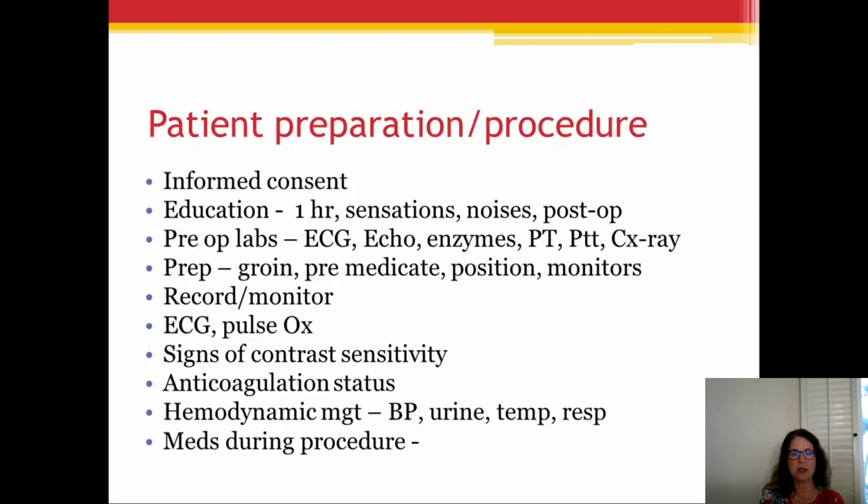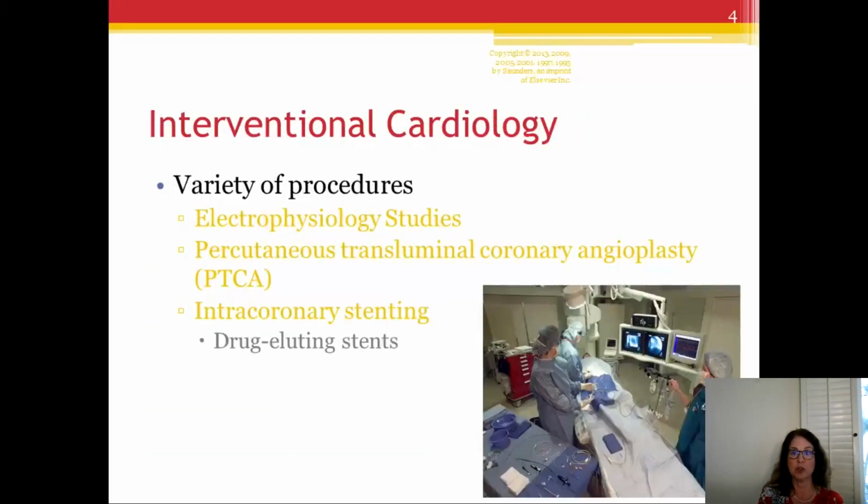What's their respiratory status? And during the procedure, you sedate, make people comfortable. So usually it's called conscious sedation. They're comfortable, they're drowsy, they're sleepy, but they're definitely breathing on their own. They're generally not under general anesthesia in a cath lab procedure. They're just groggy and comfortable.